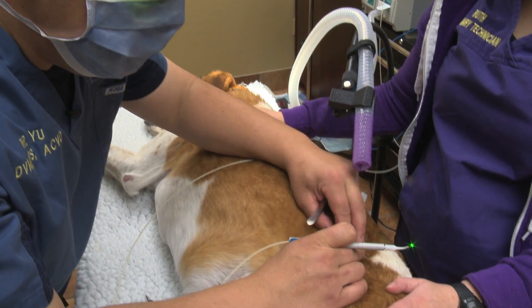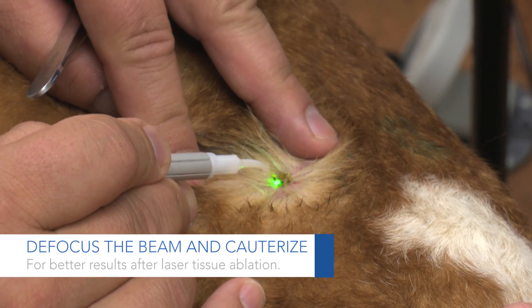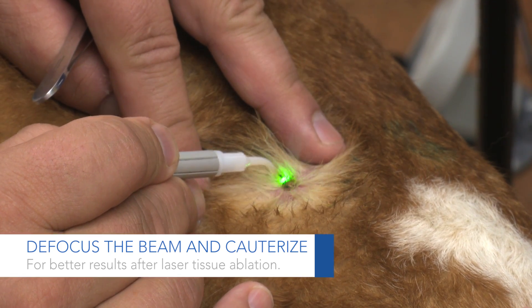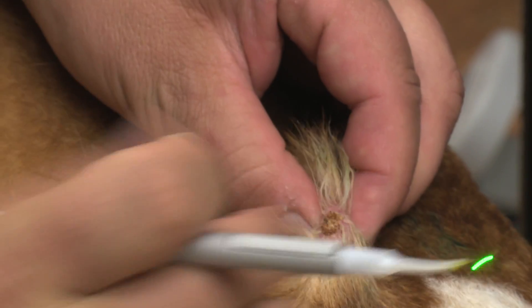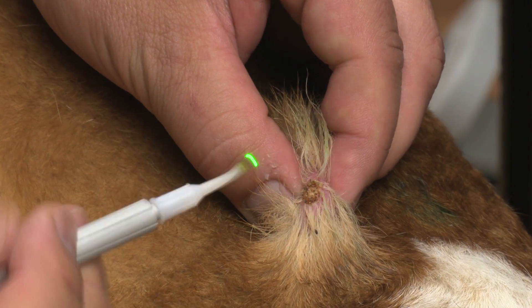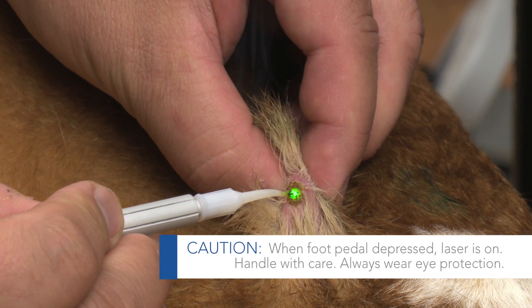Now what I'm going to do is go in here and ablate this sebaceous material. The big question is when do we stop? You can still see the affected tissue right there — it's a pale color, which is consistent with the sebaceous glands. So we're going to continue to ablate.